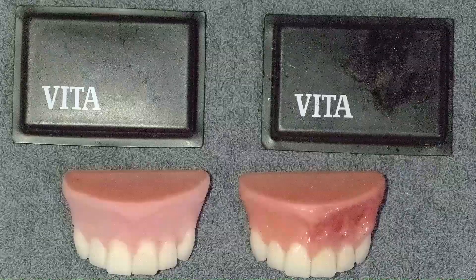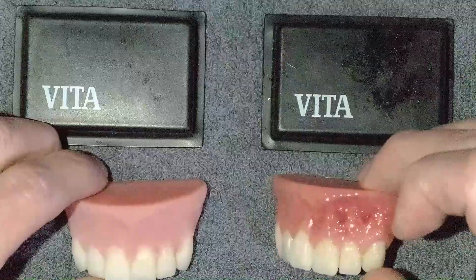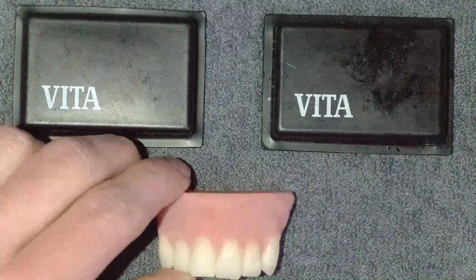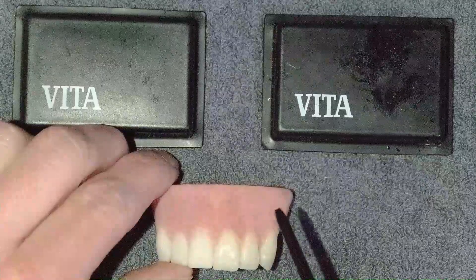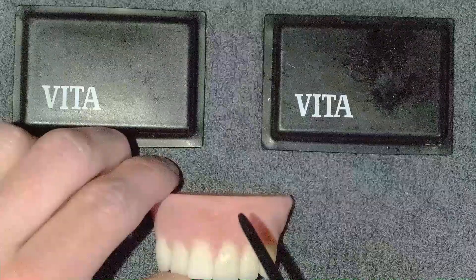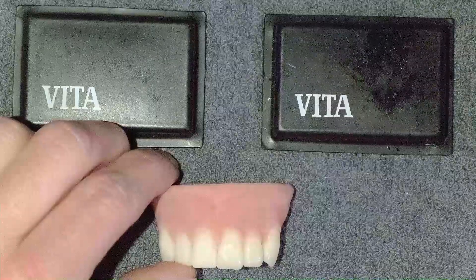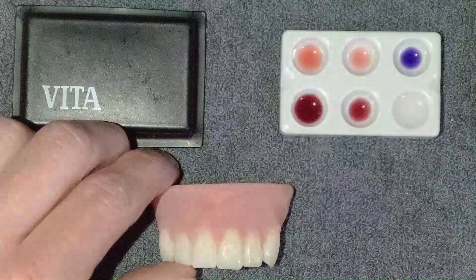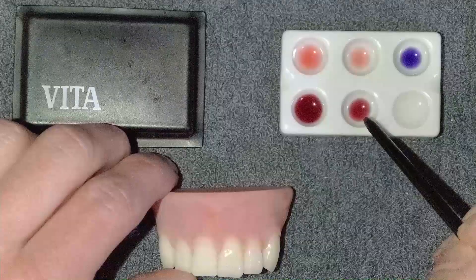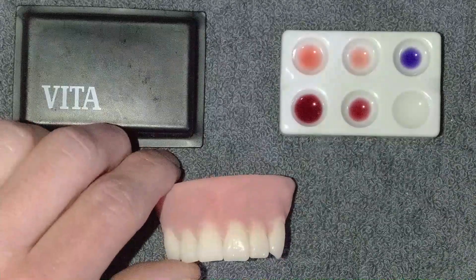Let's start by talking about a couple of different ways that you can characterize denture gingiva. I've prepared the gingiva here by lightly sandblasting it. You can also use a rubber wheel — we just want to break any glaze on the surface and give ourselves a little mechanical retention. I'm keeping this very simple, using only four colors: glaze, dark red, pink, and purple. Cream is missing but I'll come back to it in a minute.